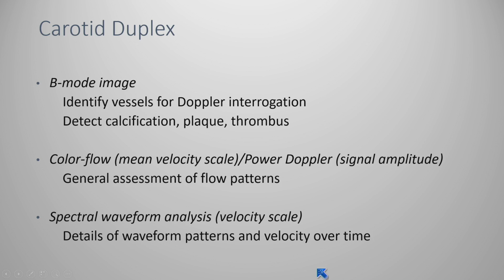And at this point, when we look at a duplex ultrasound examination, I've asked many classes over the years, what do we mean duplex? What does duplex mean? And sometimes I get an immediate answer, and sometimes I get a lot of, what does that mean? Two things. It's imaging and Doppler.